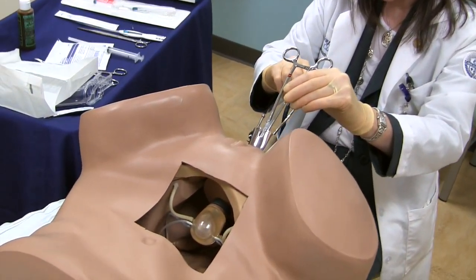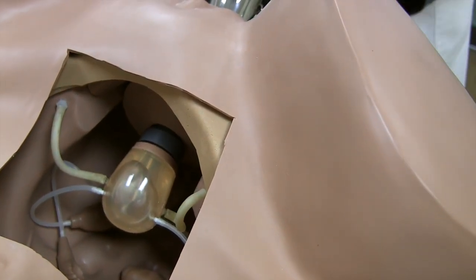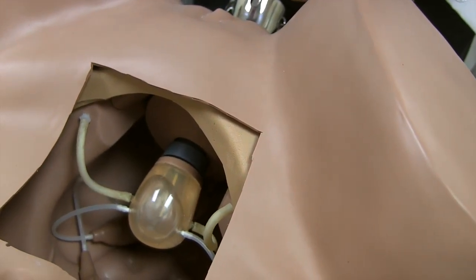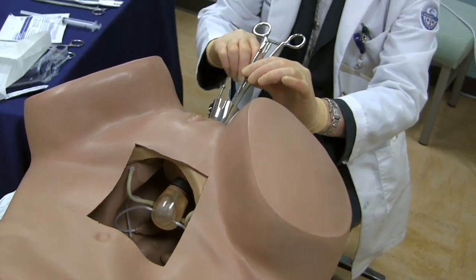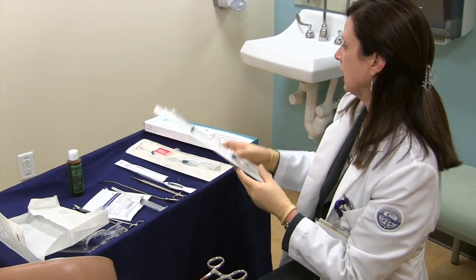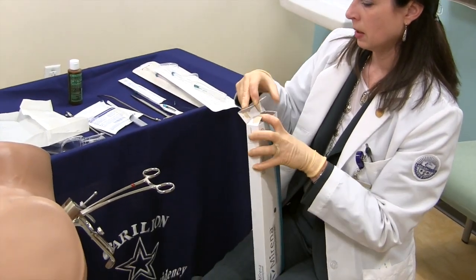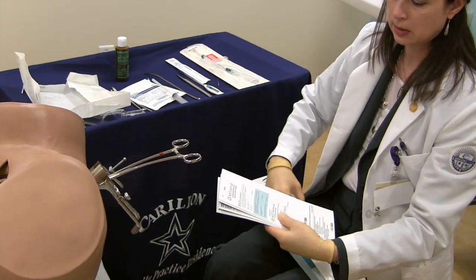Watch the students do this in a sterile manner. This is a time when you as a faculty member can be looking through that window. The other learners can be talking through that as well, instructing their peer. The learner themselves can stand up and actually see the placement and correlate that with what they're palpating on the other side. Once the sound is fully in place, the next step is using the IUD itself. You can also have someone act as the assistant in a nursing role, practicing opening up the IUD. It's helpful to have the actual box of an IUD as one of the teaching instruments, so that students can open it up and get an idea of what else is included in the box.